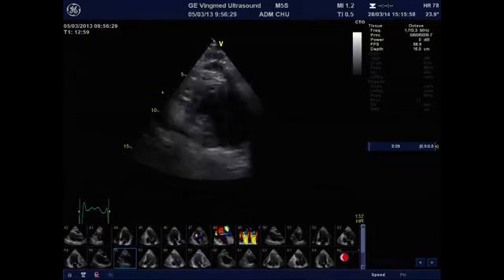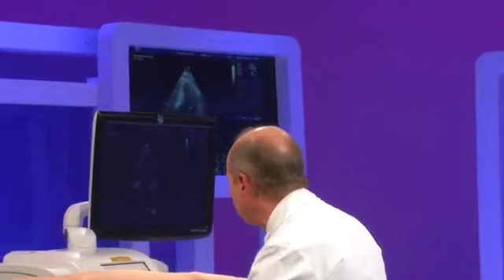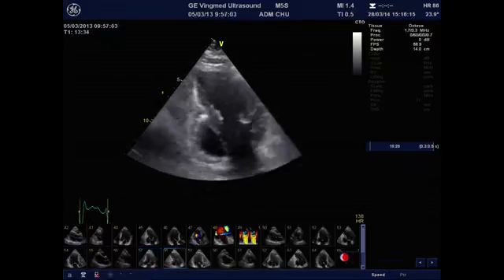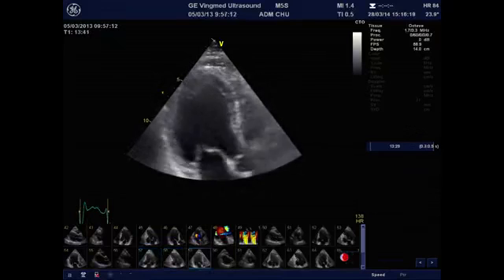This is a daily life examination, so the quality of imaging is not perfect. Perhaps we could have decided to improve the endocardial detection by opacification of the left ventricle, but we do not do that really at the end of exercise. So we take now the recovery.